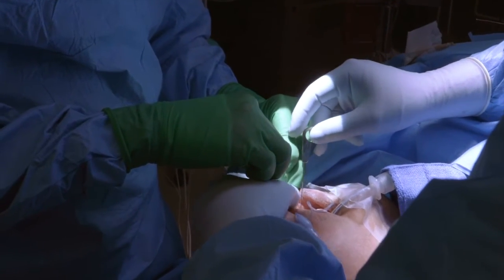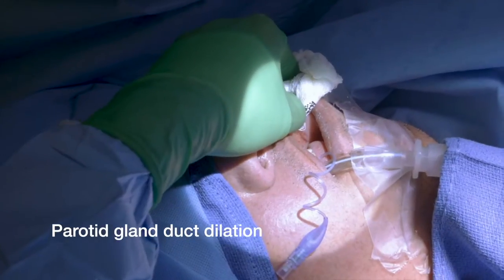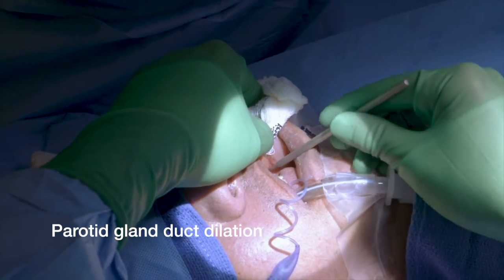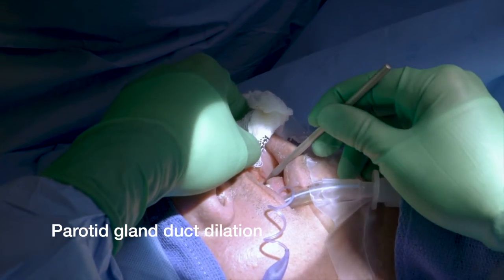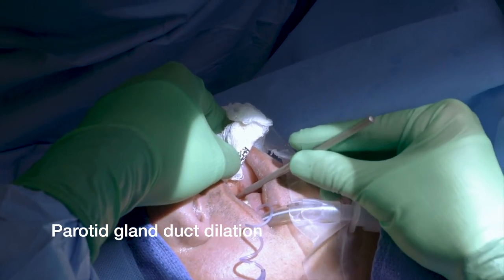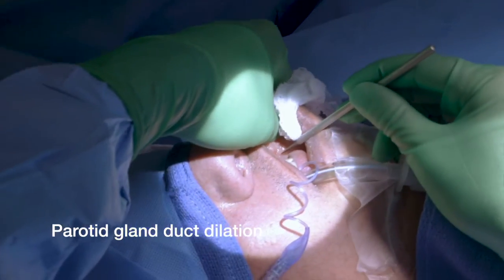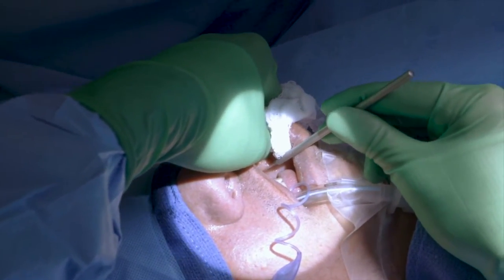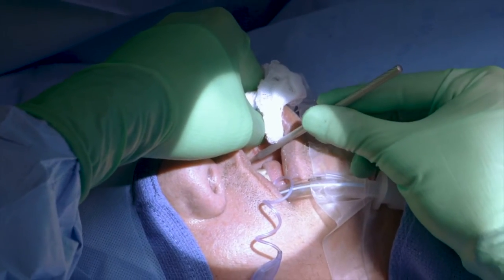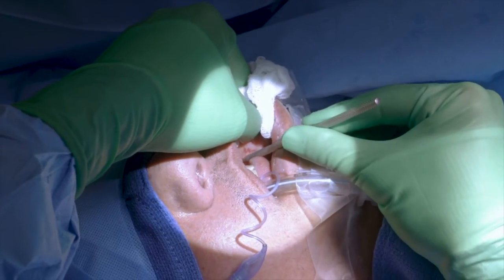As you can see here, the duct is now cannulated, and then serial dilation occurs with increasing the size of the lacrimal probe. Here you can see the use of the conical dilator. Once you've dilated to a certain extent where you can visualize the opening, the conical dilator can help finish the dilation, and you're prepared for introduction of the sialendoscope, or if you prefer the use of a sheath, you may place a sheath at this time and then the sialendoscope afterward.